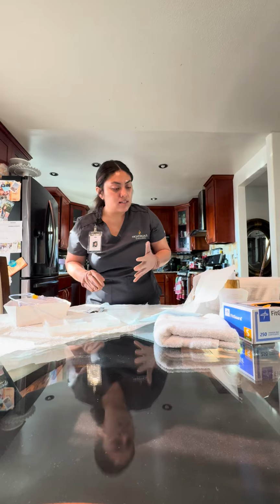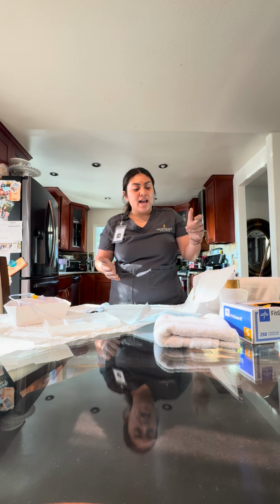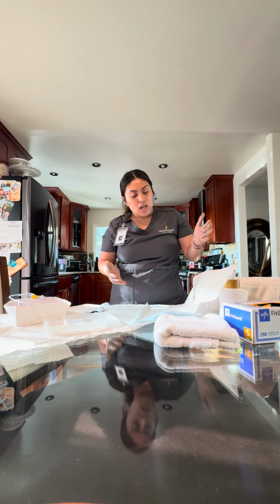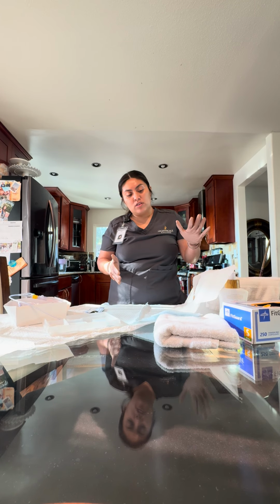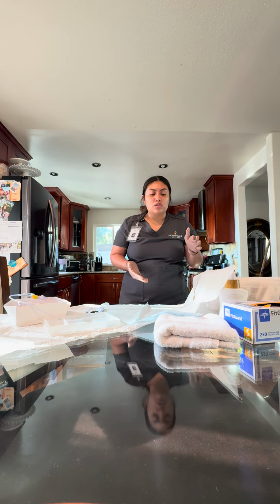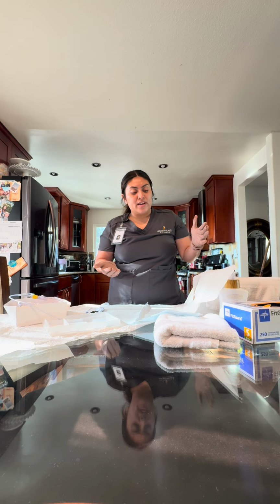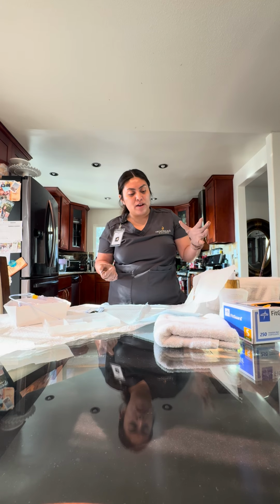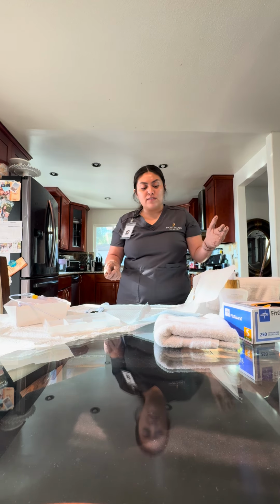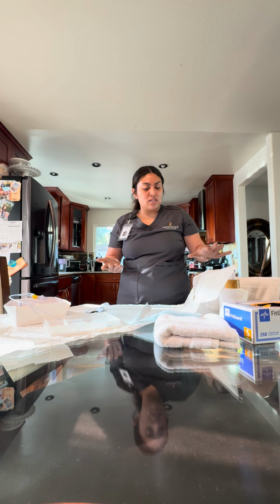Now that has been placed, I'm going to let my patient know, okay, ma'am, I'm going to be starting the procedure, noting that once my non-dominant hand is placed on the patient, it does not move from the field, to avoid any contamination of the sterile field. I'm also going to ask that my patient not move, also to prevent contamination. Ma'am, I'm going to begin the procedure, try not to move. You may feel a little bit of discomfort. If you want, feel free to bear down. It should help a little bit with the discomfort.